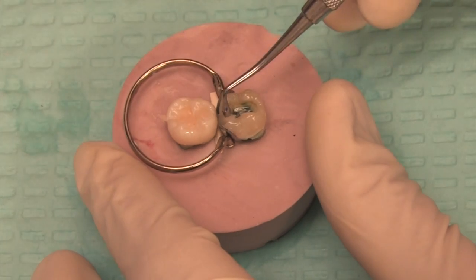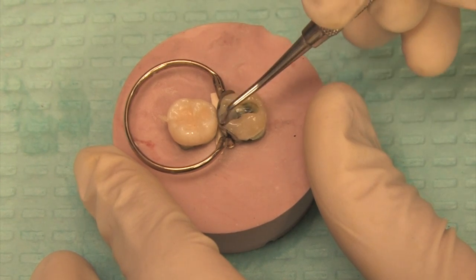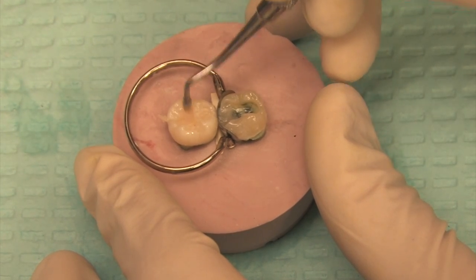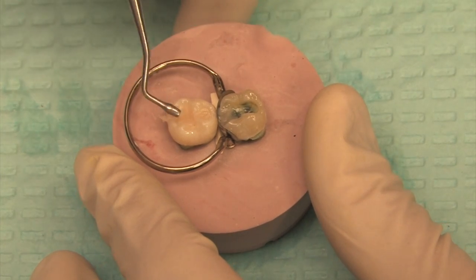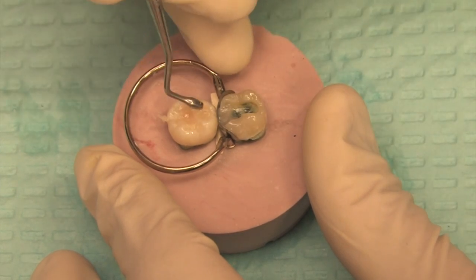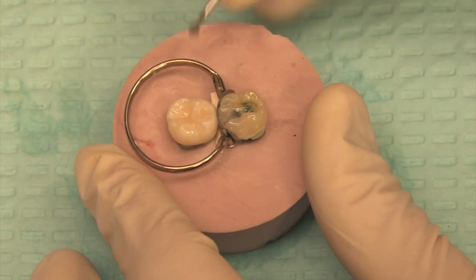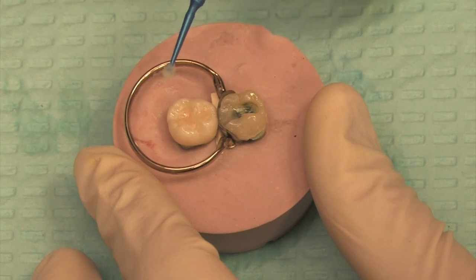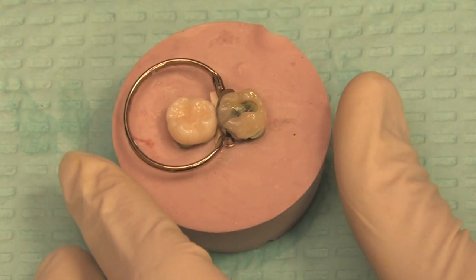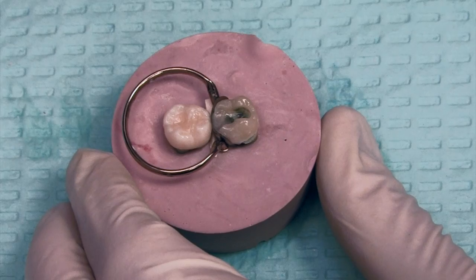Start packing this stuff into position. I use a plugger instrument — it has a flat, round barrel-shaped surface. Just packing it into position. For that interproximal area, I'm making sure that when I push it in there, that flowable is kind of oozing up on the buccal and lingual surfaces. As I'm going over to the other tooth with the two smaller fillings and pressing the material down, I'm also pulling it across the teeth laterally, just feathering it into position. Optionally, I can go in with that blue brush that has the bond on it and feather the edges to make sure we have a very nice seal all the way around.